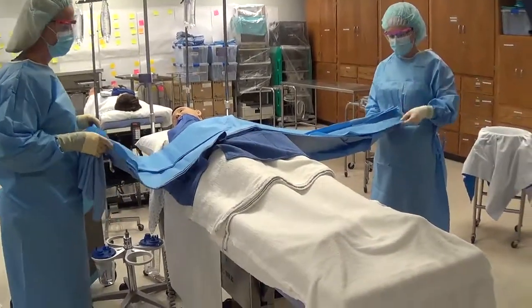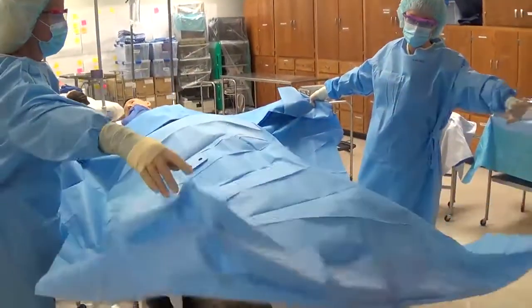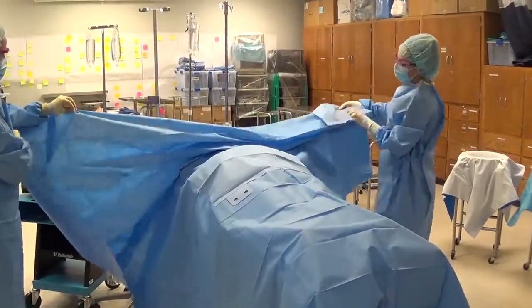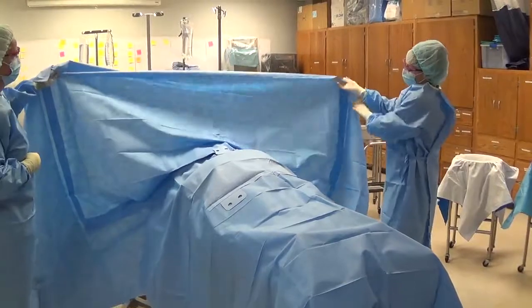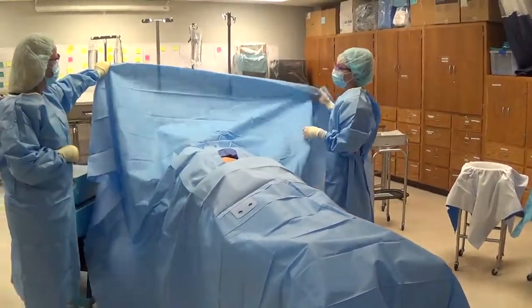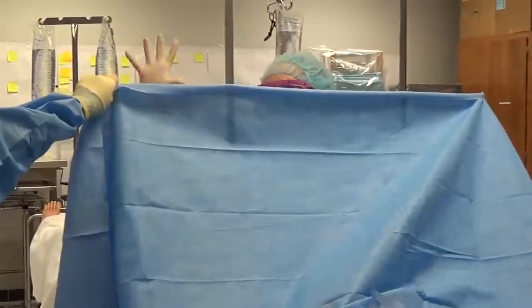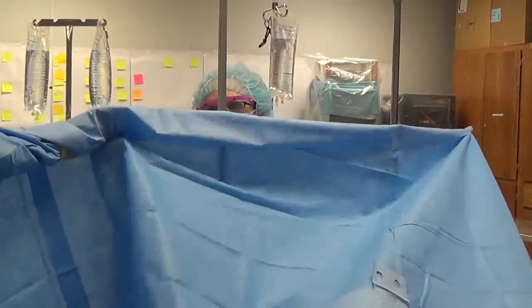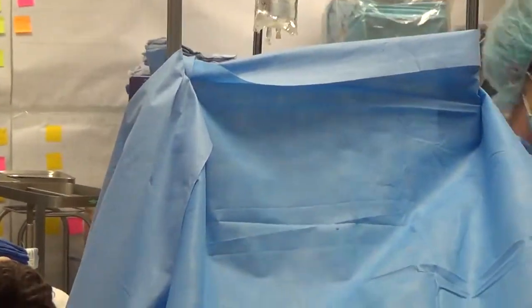Make sure you're not following the drape down — just allow it to drop, don't go down with it, and avoid making waves and air currents. This drape has arm board covers, so open those up. Cuff your hand and extend up to anesthesia, waiting for them to attach it to the IV poles. Anesthesia often doesn't look — they just grab at the drapes, so make sure your hand is protected by cuffing it inside the drapes so if they touch you, you're protected from contamination.